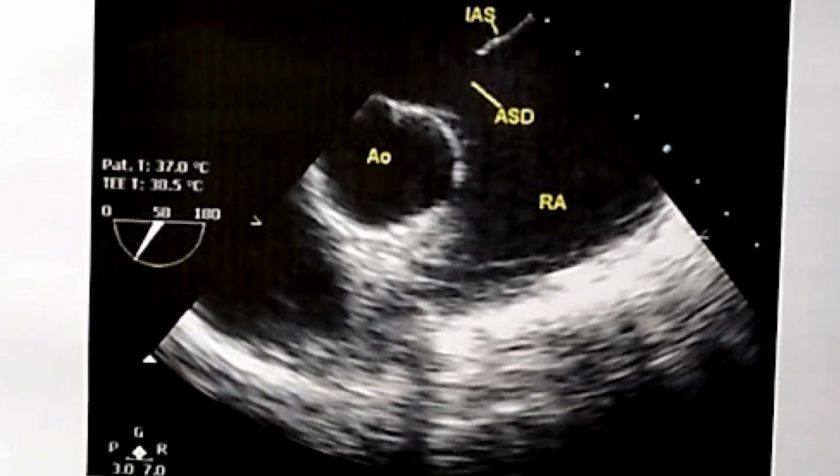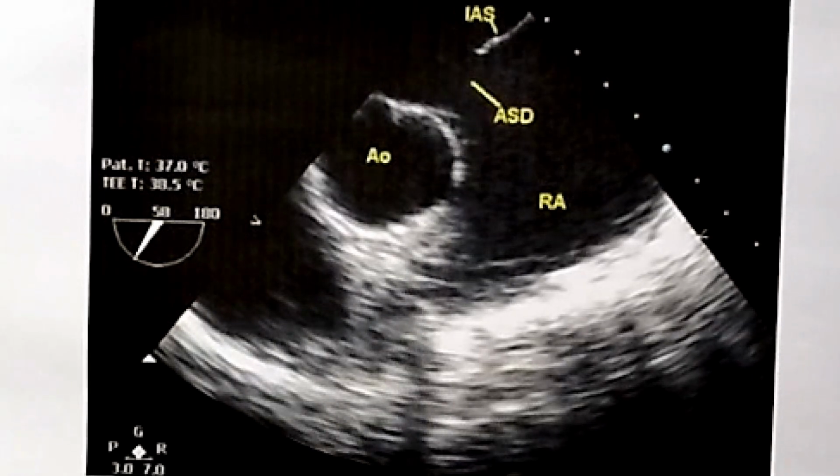Another advantage is that in transesophageal imaging, unlike transthoracic imaging, lung doesn't overlap the heart, so an excellent echo window is possible. The only disadvantage is that it is semi-invasive. There could be some discomfort during the procedure, which requires careful monitoring.